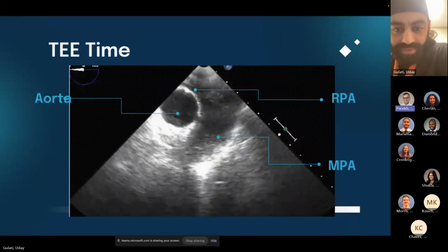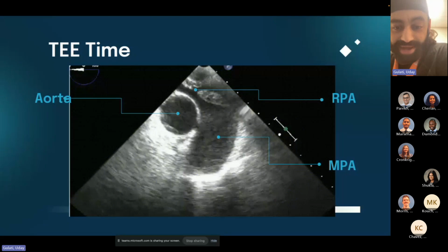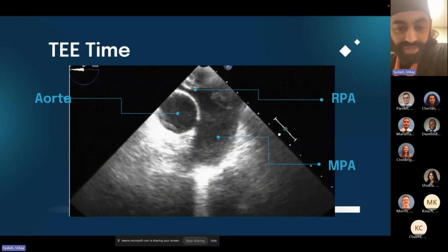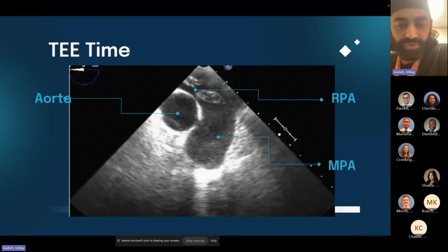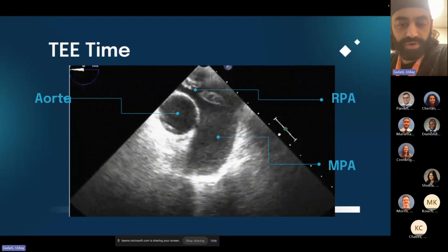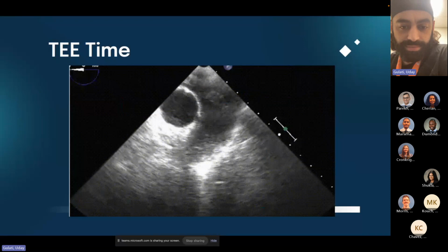A long lost friend. Yeah, I'm looking at this and I'm saying, someone hand me TPA, please. And if I'm concerned about this patient, let's get ready to cannulate this guy. But you can imagine, I don't think this is the guy that you want sitting in a CT scan. I think this is the guy that, if you had a transesophageal probe as a MICU intensivist, you'll get this picture, you'll take a video, you'll call your interventionalist and let them know that, hey, we're strongly considering, you should get in here now for a clot extraction.